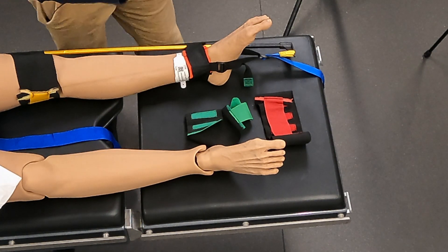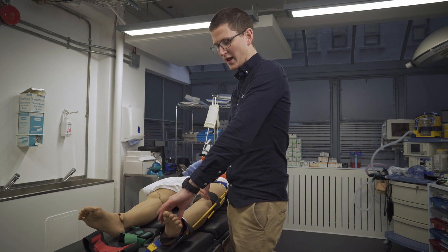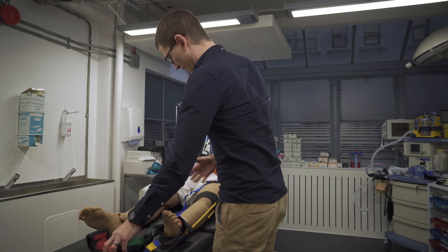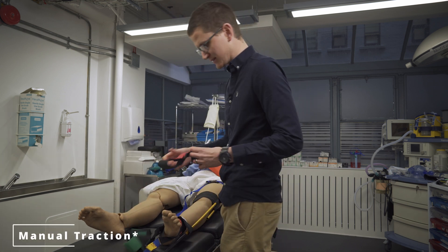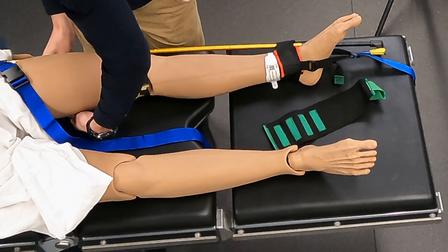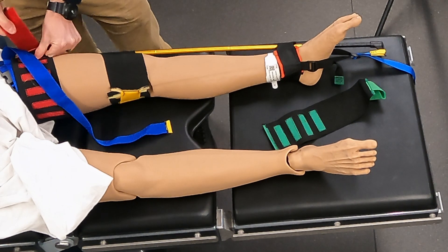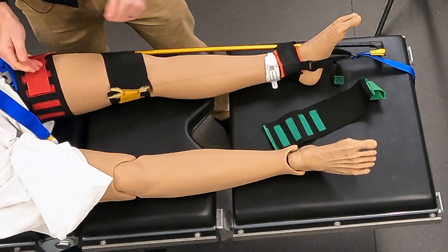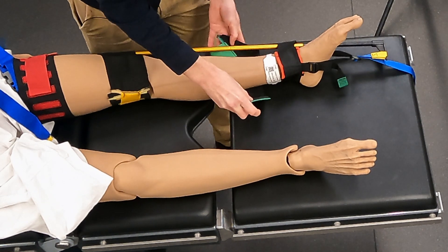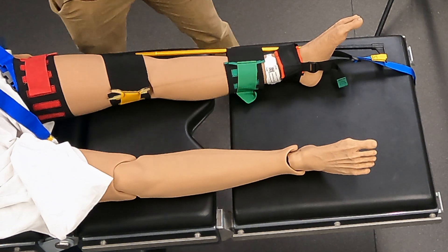How far do we pull? Until the injured leg is equal in length to the other leg. Once that's done, we check again: do we have pulse, warmth, motor, and sensation? Once confirmed, traction has been applied and inline manual traction can be released. Then there are two more straps: the red one goes above the injury on the thigh — not over the injury — and the green one goes on the ankle. These keep the pole inline next to the leg.